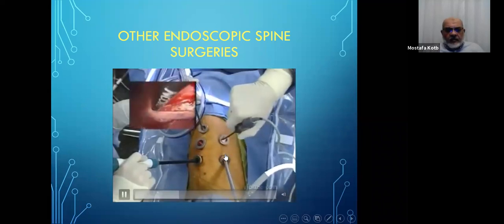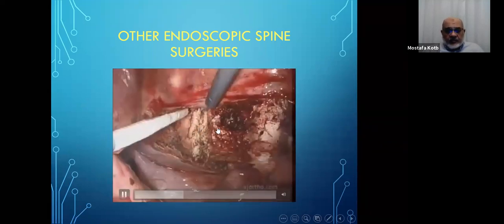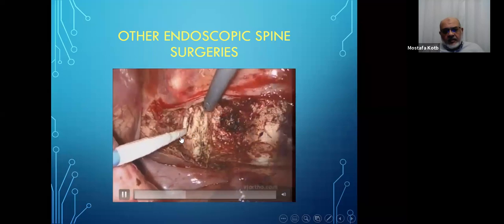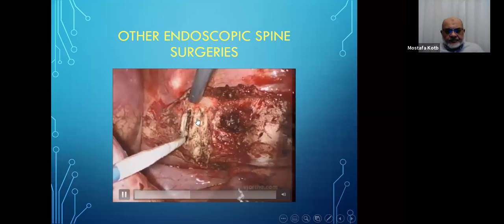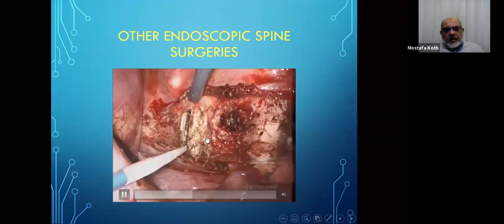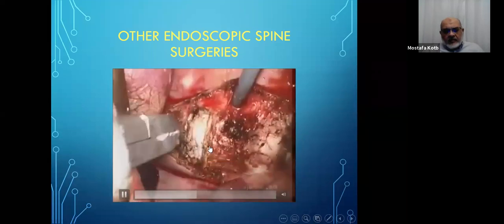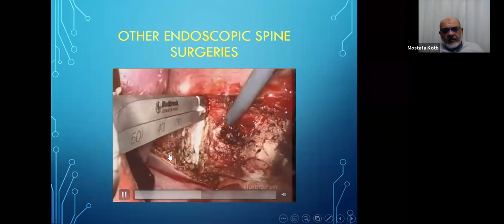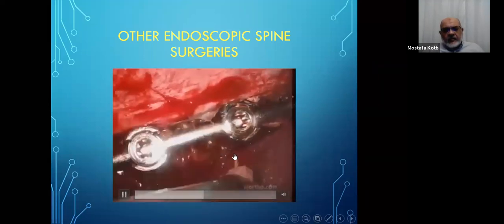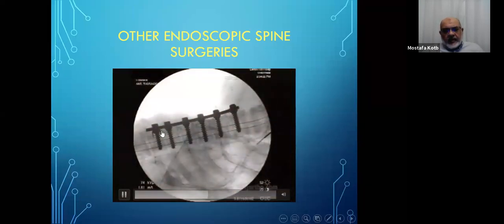As for the dorsal spine, you go through a regular thoracoscopic approach. Here we are removing a disc prolapse. And in this case, we removed the disc and did a fusion using body screws and rods.